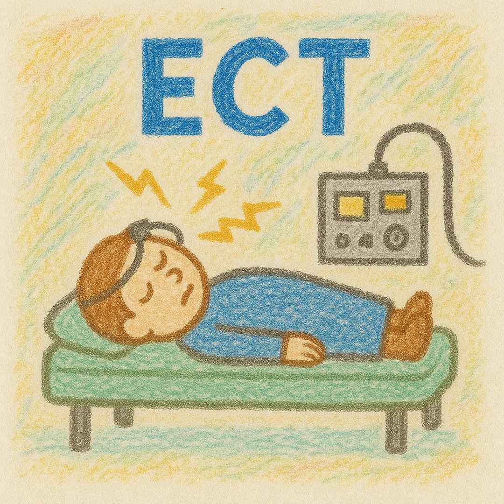And just to put that in comparison, some of the electrical cardioverters are sometimes up to 360 joules. So ECT machines are generally putting out less energy than a cardioverter. The charge is basically the overall dose that you're delivering. And again, it's measured in millicoulombs.